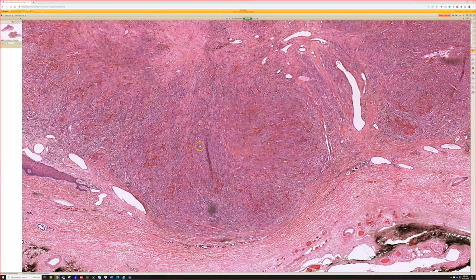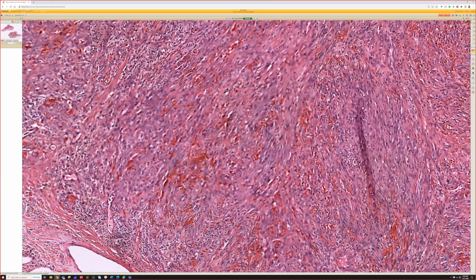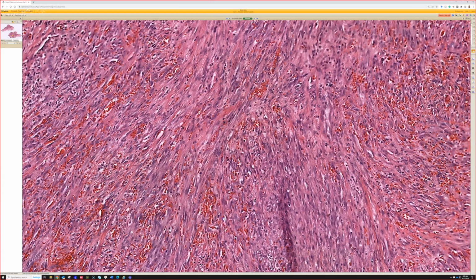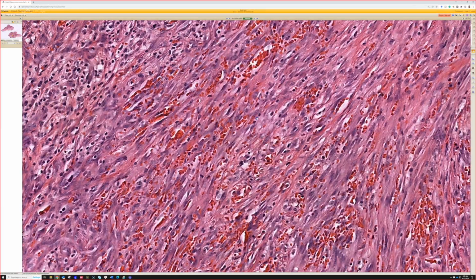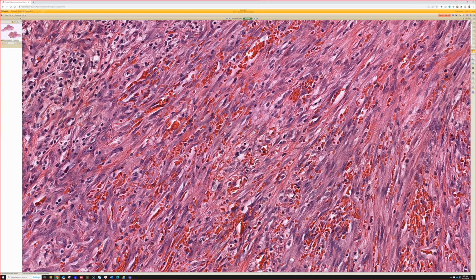And then looking in here, I thought the fascicles of cells were moving through, and there's blood cutting in between them. It's hard for me to describe it well, but I feel like this looks good for Kaposi's, just how the blood and the cells are sort of traveling together. You described it perfectly. I like that description. Thanks, Dr. Gardner. Yeah, this is Kaposi.